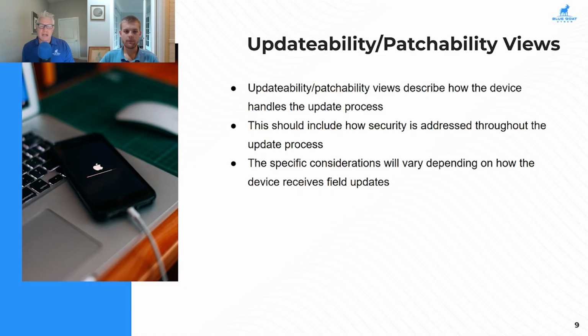Yeah, and I guess it doesn't have to be USB. It could be Bluetooth or some other mechanism as well for a physical update. I know one of our clients in the past used software that basically did whitelisting of what type and what manufacturer of USB drive could be put into the device for the updates. That was their solution. I don't know if that's the most effective because there's a lot of overhead in the device, but that's what they came up with. Yep, and there are a lot of different ways to go about that process.